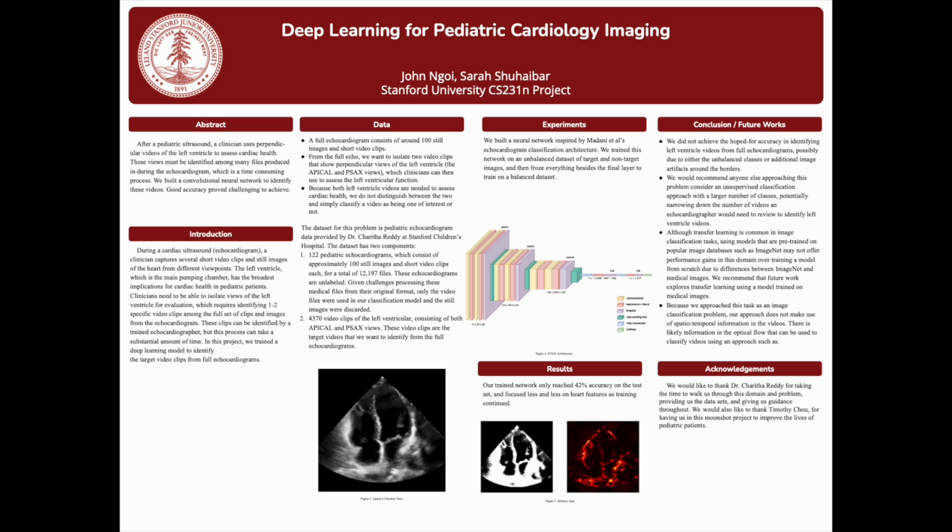The dataset for this project is pediatric echocardiograms provided by Dr. Charita Reddy at Stanford Children's Hospital. The dataset has 2 components. First, 122 pediatric echocardiograms, which consist of approximately 100 still images and short video clips each, for a total of 12,197 files. These echocardiograms are unlabeled. Given challenges processing these medical files from the original format, only the video files were used in our classification model, and the still images were discarded.